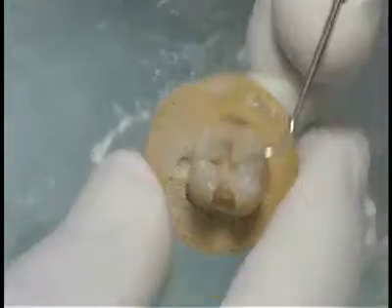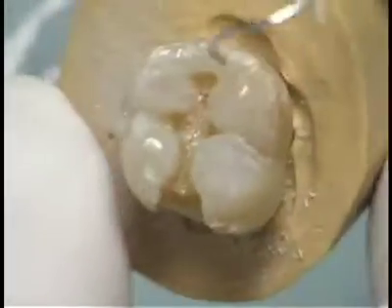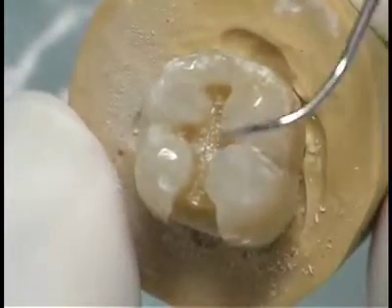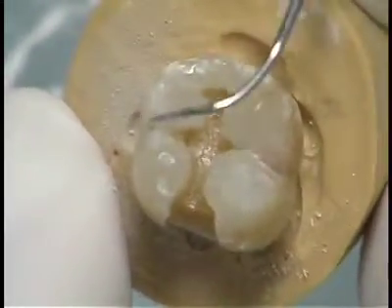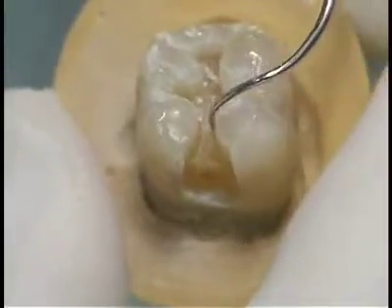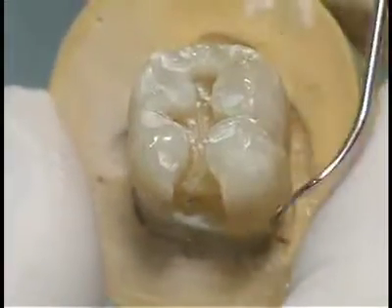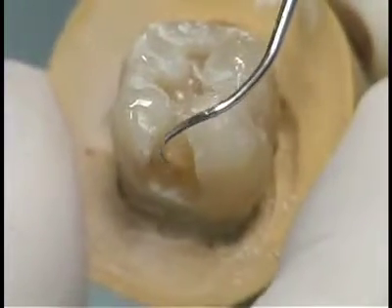To review, the occlusal segment was developed and the pulpal floor placed approximately 0.5 mm into dentin. All walls were connected with a smooth curve, and there are no catches in the groove area. There is now smooth and continuous flow of the preparation. The reverse curve was established. The axial wall was rounded to follow the external outline of the tooth structure and is 0.5 to 0.8 mm into the dentin.